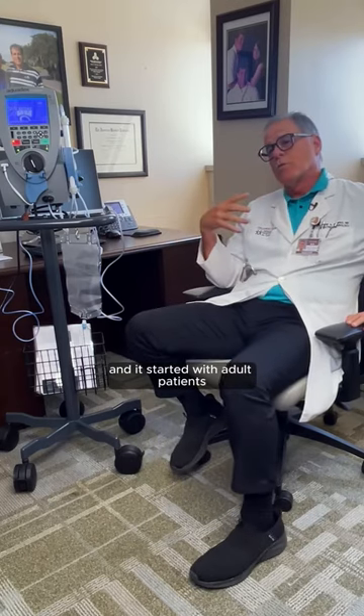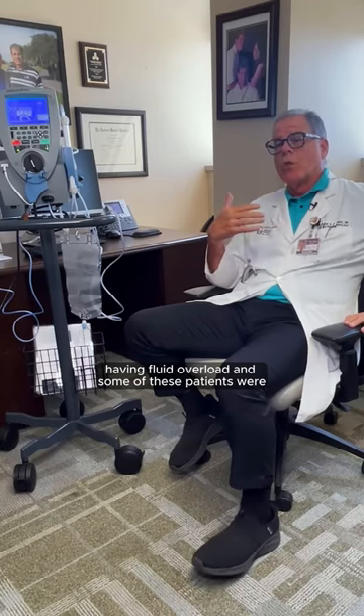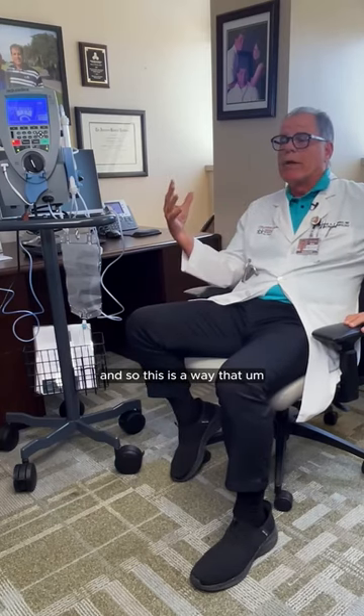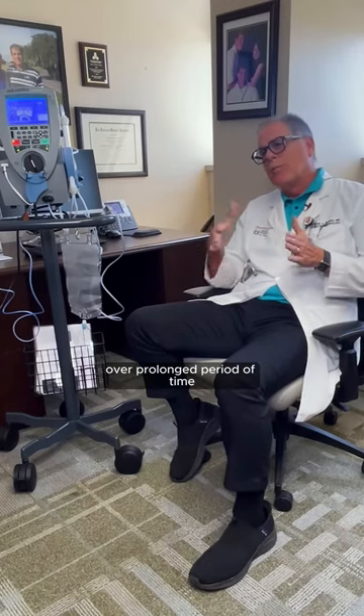It started with adult patients who had congestive heart failure and were having fluid overload. Some of these patients were resistant to oral diuretics to make them void, so it was important to remove fluid from them. This is a way that we can remove fluid gently over a prolonged period of time.